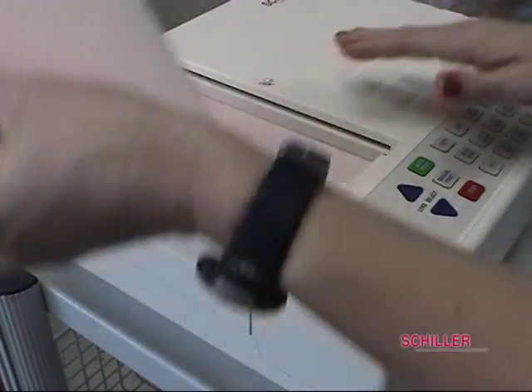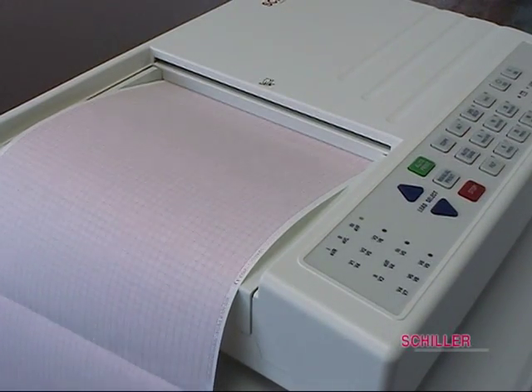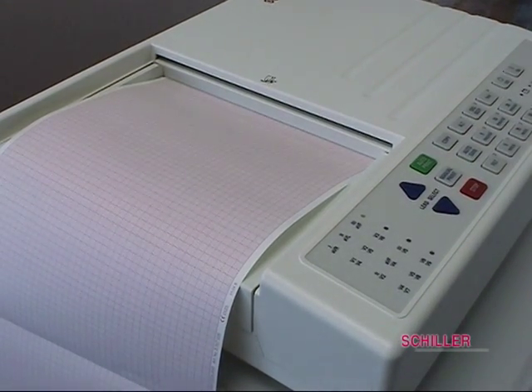Never run paper through rollers. Always make sure that you have a tight fit and the tray is forcing the paper against the thermal printhead.